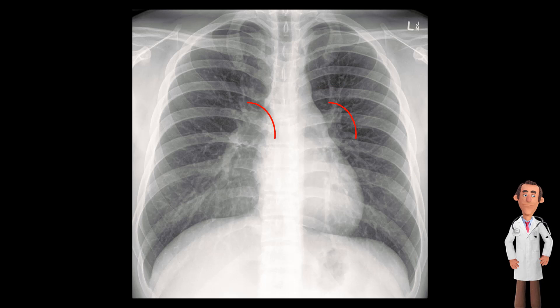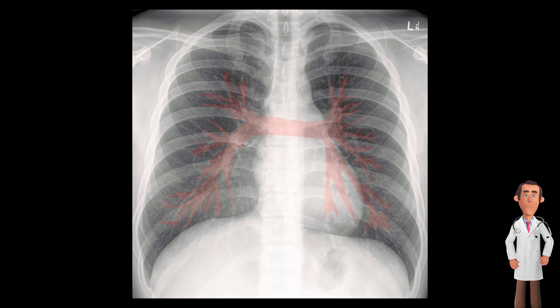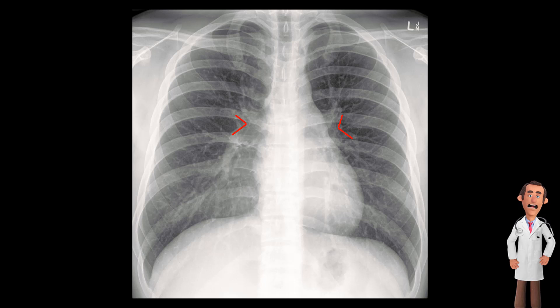Next, the lung hila. These are the faint structures you see around and behind the heart. The hila consists of pulmonary blood vessels, main bronchi, and lymph nodes. Lymph nodes are typically not visible in a normal chest x-ray. There is also an indentation on each side called the hila point.